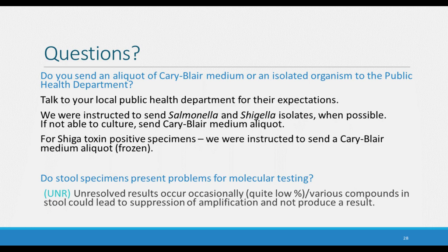Do stool specimens present problems for molecular testing? After all, it's poo, it's a messy specimen. Is it going to cause a lot of problems with amplification? We've had very, very little problems with amplification. We've had very few so-called unresolved results. They do occur on occasion, well less than 1%. There are various compounds in stool that could lead to suppression of amplification that leads to an unresolved result and does not produce a result.